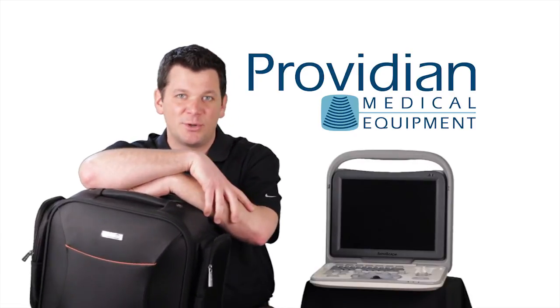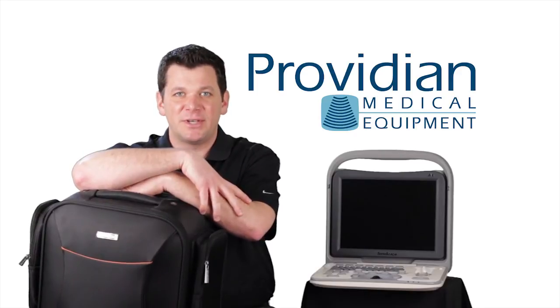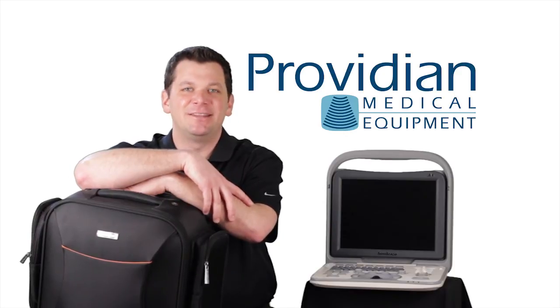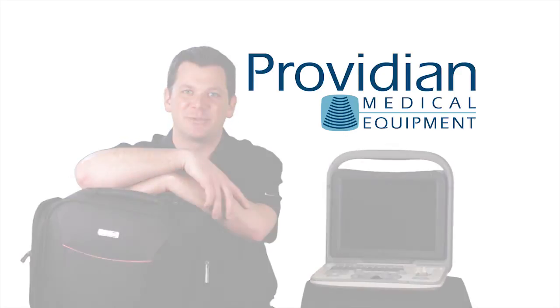So if you're interested in the Sonoscape A6 ultrasound machine or something similar, one of our sales experts can help you make the best decision about your ultrasound machine. I'm Brian Gill with Providian Medical, and that's what you need to know about the Sonoscape A6 portable black and white ultrasound machine.